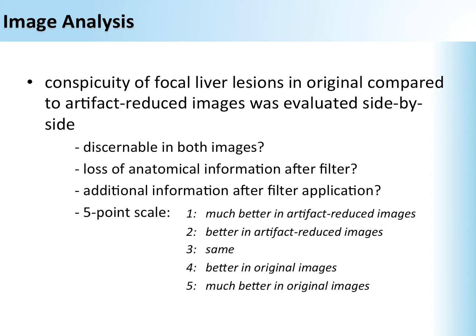Additionally, the lesion conspicuity was also evaluated by comparing the original and the artifact-reduced images for selected lesions. So especially we had a look at, are lesions still discernible on both images, or have we lost anatomical information after the filter, which is a quite often occurring phenomenon of those filters? Or do we even have additional information after the filter application? And this was also evaluated on a 5-point scale.